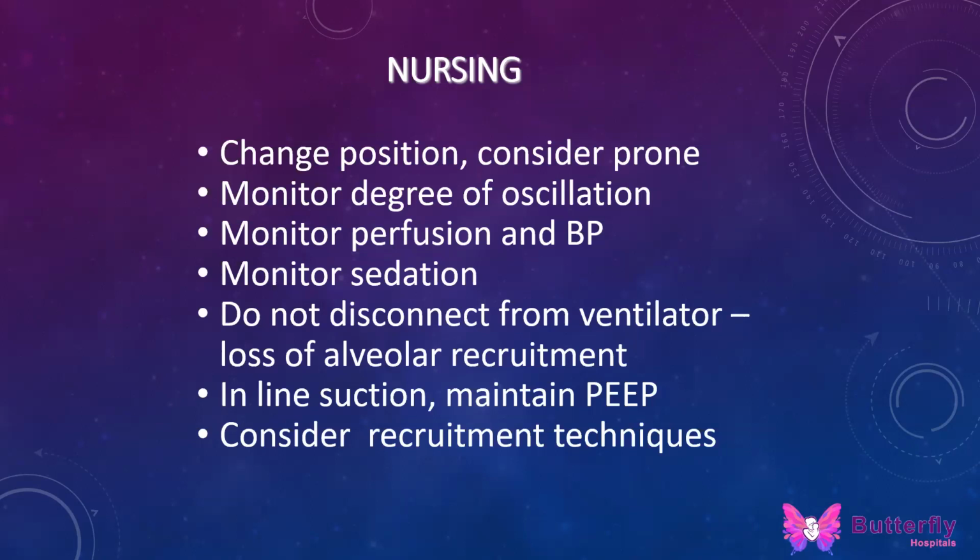The nurse needs to keep checking, or the junior doctors, or whenever you're at the bedside, you need to keep checking that the wiggle is happening. And to prevent the complications of hypotension, the perfusion, the blood pressure needs to be monitored because of the high frequency of the ventilation.